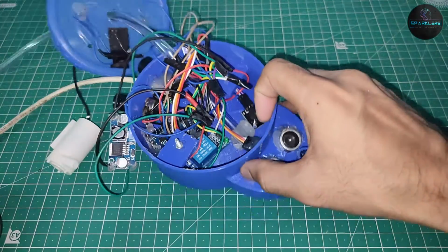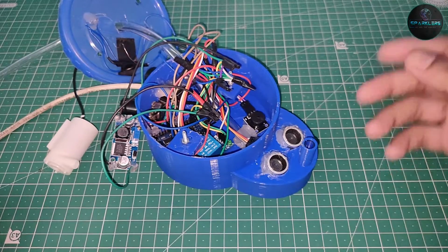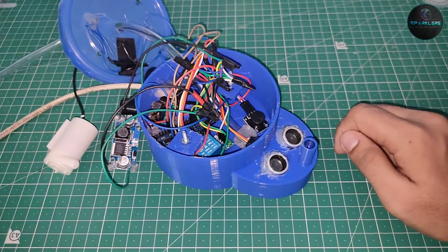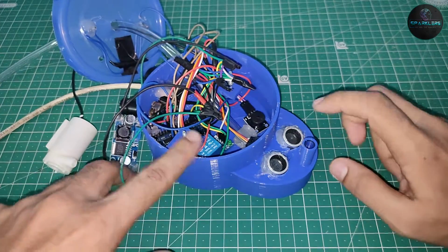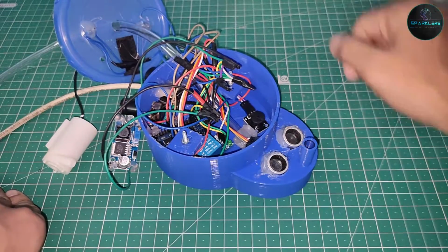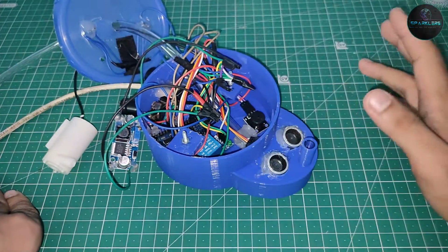Now for the buzzer, there is a buzzer inside this. Whenever it pumps out the sanitizer, it will just beep. And same for the LEDs. Whenever it pumps out the sanitizer, the LEDs will light up. Not blink, they will just show up. Now here the connection is easy.